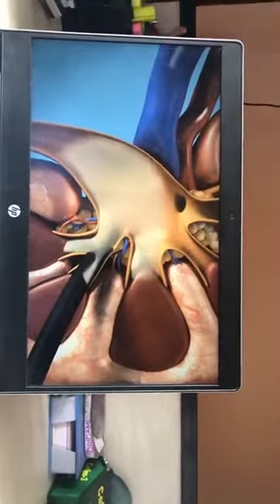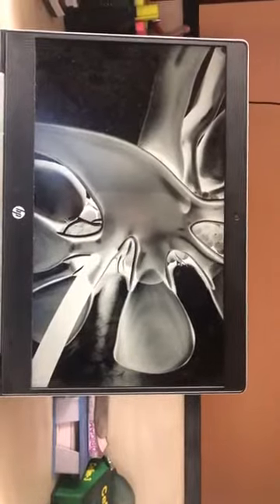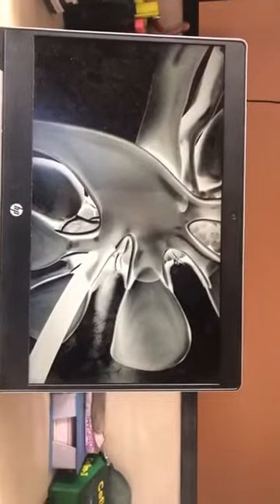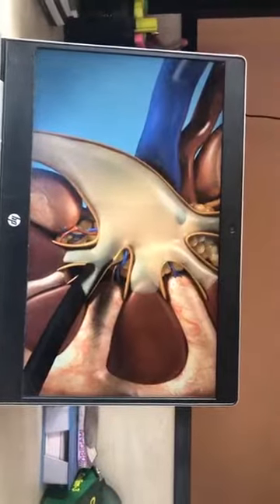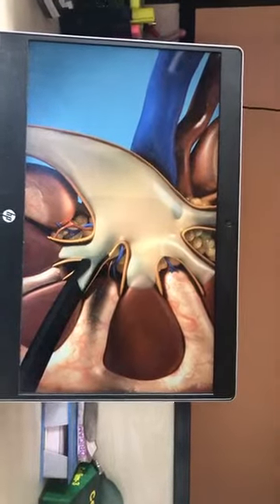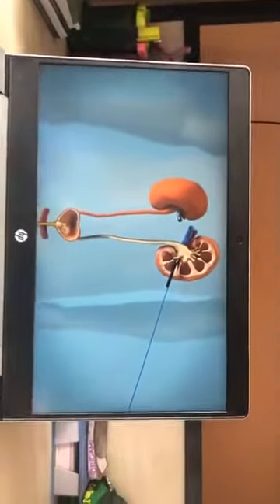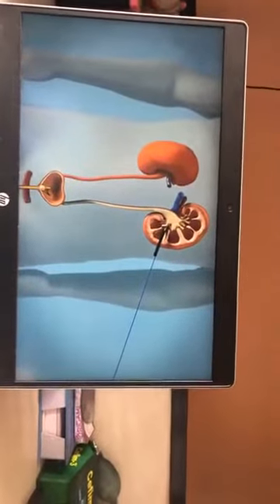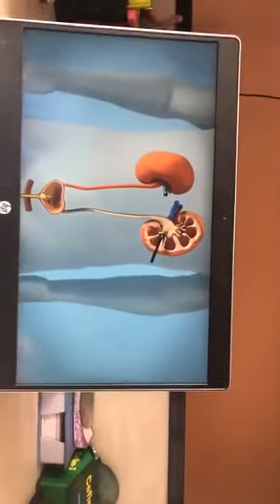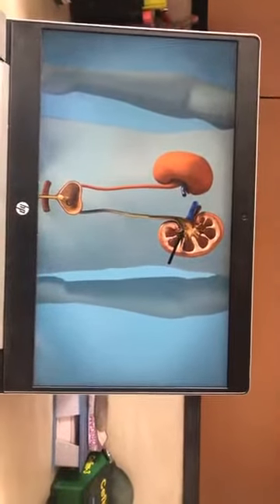And after that, put a tube through the opening and another stent is given inside the ureter. So the rest of the stones and debris can come out through the ureter to the bladder when there is a stent inside the ureter. A double J stent may be placed to ensure that swelling doesn't block the drainage of the urine. So this is called percutaneous nephrolithotomy.